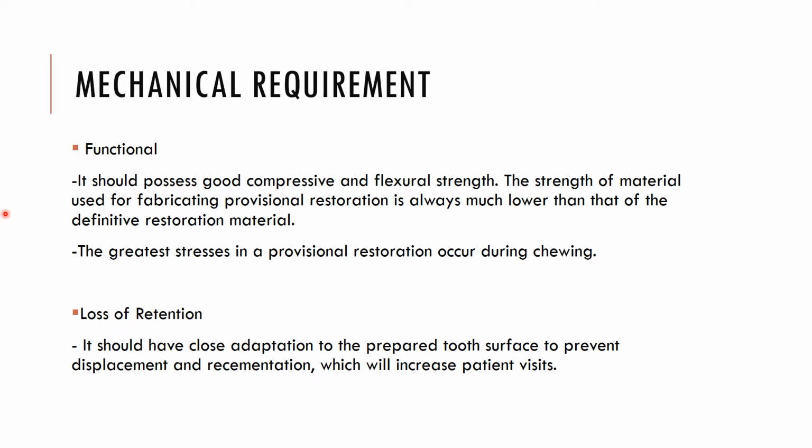Functional requirement: it should possess good compressive and flexural strength. The strength of the material used for fabricating provisional restoration is always much lower than that of definitive restorative material, but still it should be able to withstand normal forces. The greatest stresses in provisional restoration occur during chewing.